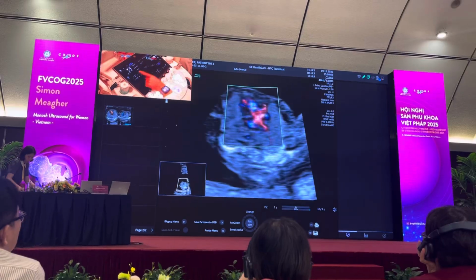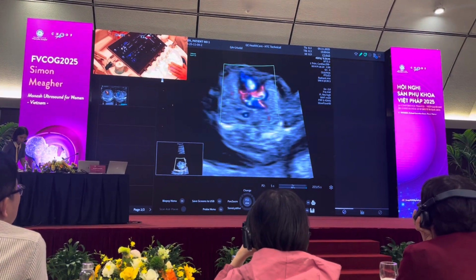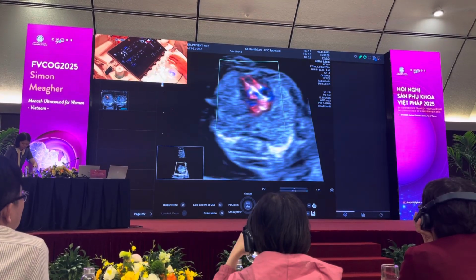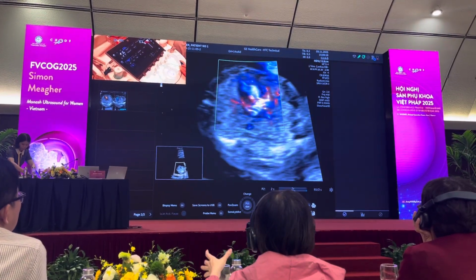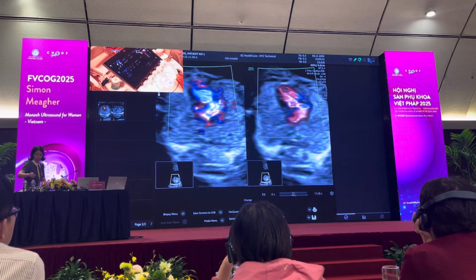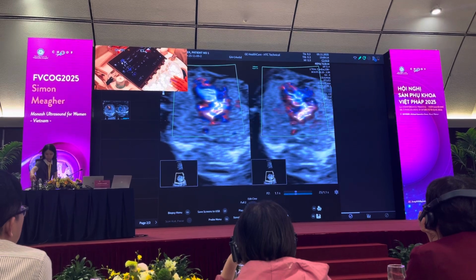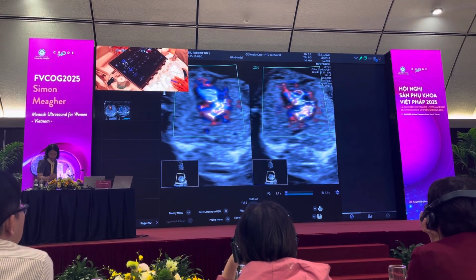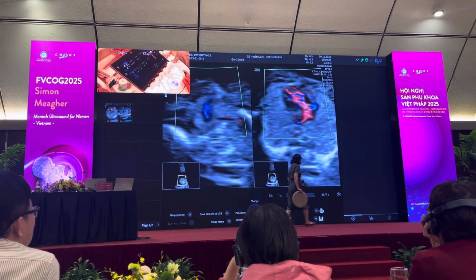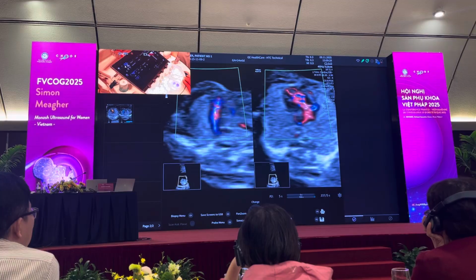When I'm looking at this at the beginning, I'm going to turn my background off. Background on. And again, I'm just looking at slow flow to see if there's any fill of that left cardiac ventricle. And then as I sweep, I do the exact same exercise where I put the four chamber on the right hand side of the screen, where I just show the right ventricular fill. I put that in red, and then I update my image to show the main pulmonary artery coming out of the right ventricle.